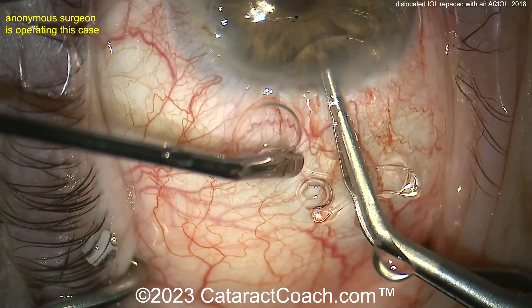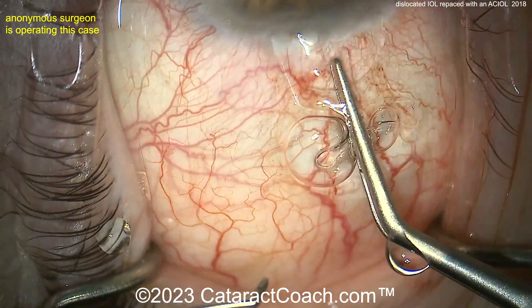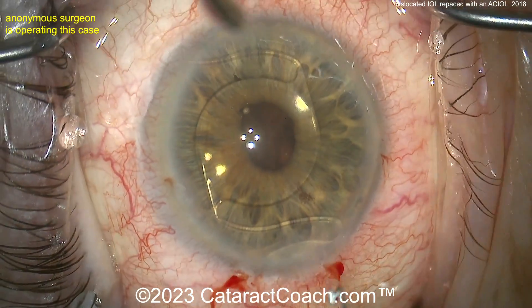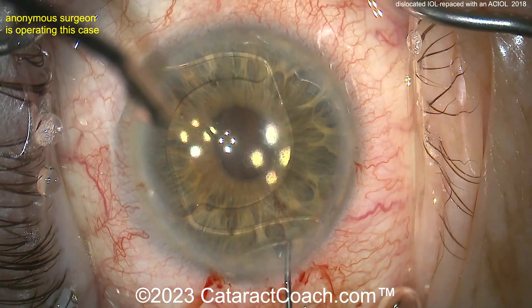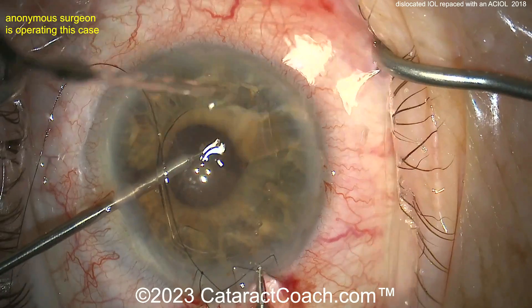Looks like more miotic agent — the pupil does not appear peaked, so maybe you don't need vitrectomy. Here's the AC lens being placed inside the eye, anterior chamber full of viscoelastic. To place this anterior chamber lens, you have to check: is it the correct orientation or is it flipped over? You don't want to put it in upside down — these lenses are vaulted. Look at the haptic-optic junction; that should be like a traditional IOL placed in the posterior chamber. That looks good — good positioning, pupil is not peaked.